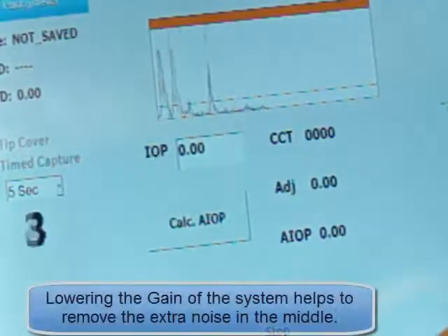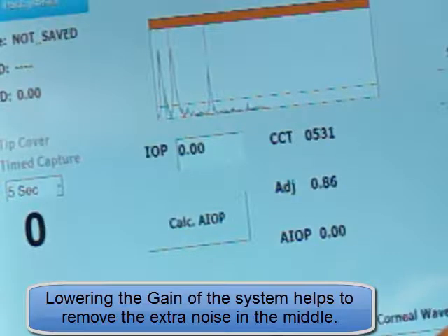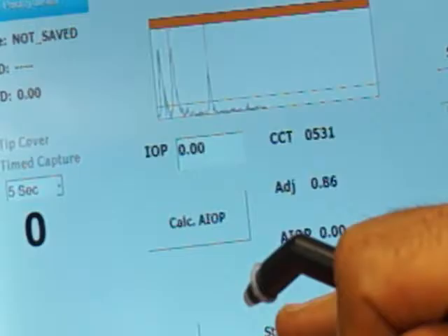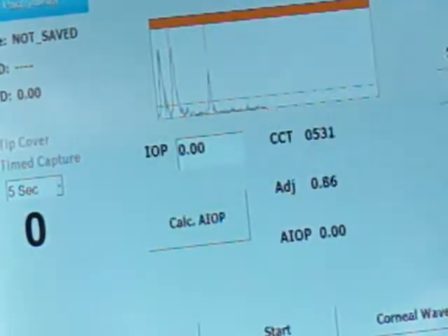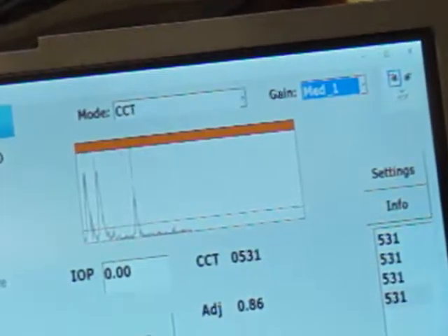And you achieve that by moving the card, moving the probe until it gets rid of that middle spike if it's there, or you can decrease the gain because the gain on the card is a lot more than the gain on the cornea.